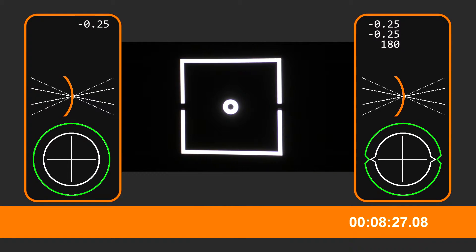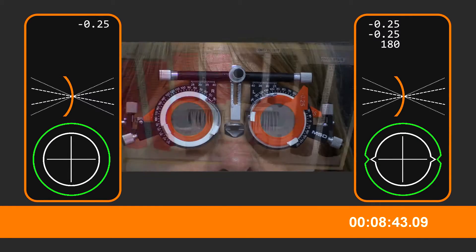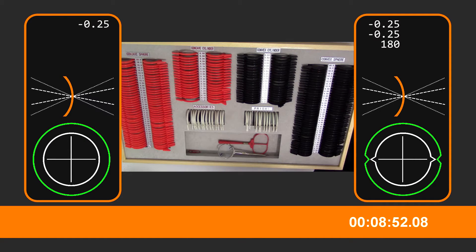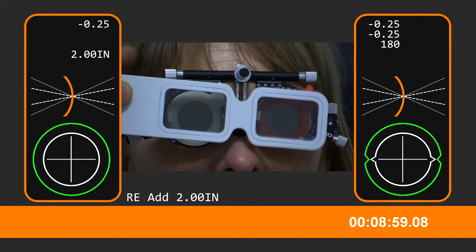So the little things — if I hold that over, can you see the squares? Yeah. You can see them like that — they're in a full box, don't they? Yeah. And then if I put this one in, are they making a full box now? Not quite, but they're not far off. Not far off? Yeah. And what about now?